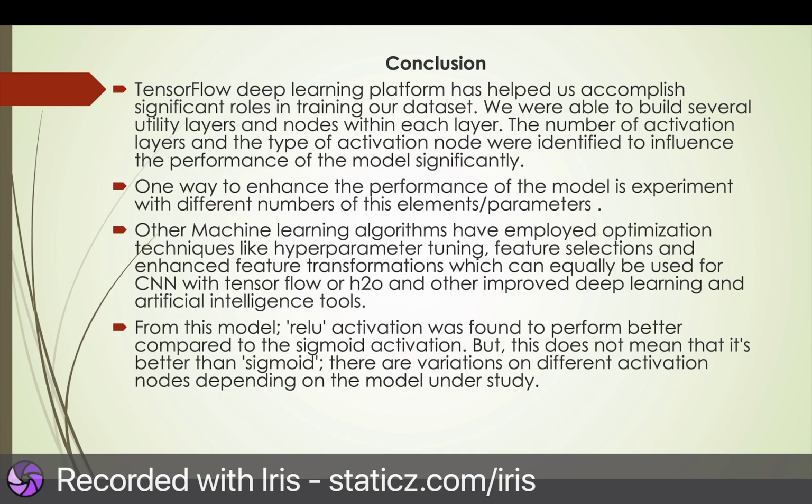Without much ado, I'm coming to the conclusion of this, and this is my observation. TensorFlow deep learning, which I used in this case, Keras TensorFlow, has helped accomplish significant goals in training our dataset. We were able to build several utility layers and nodes within each layer.